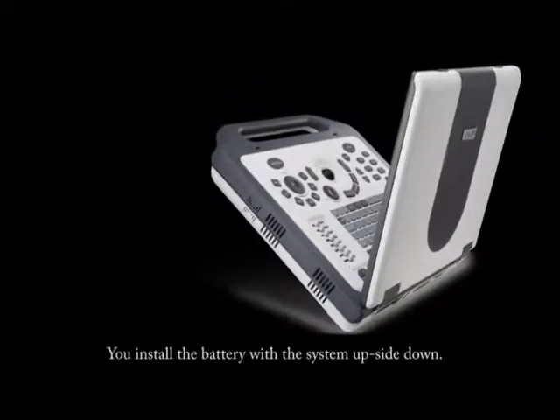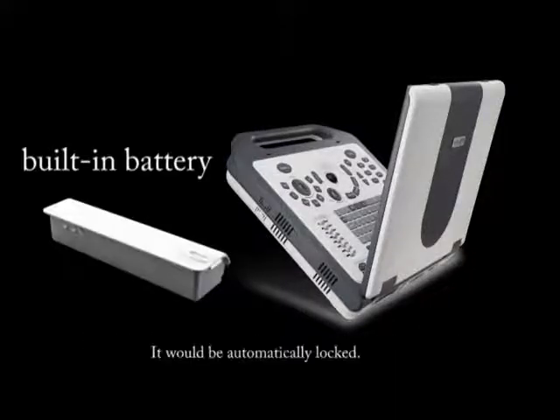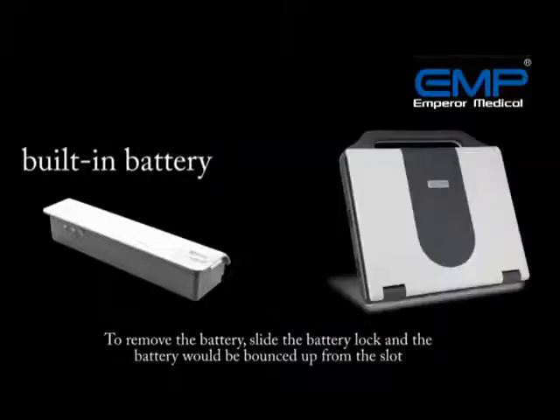You can install the battery with the system upside down. Insert one side of the battery into the battery slot, then press down the other side of the battery — it will be automatically locked. To remove the battery, slide the battery lock and the battery will bounce up from the slot.